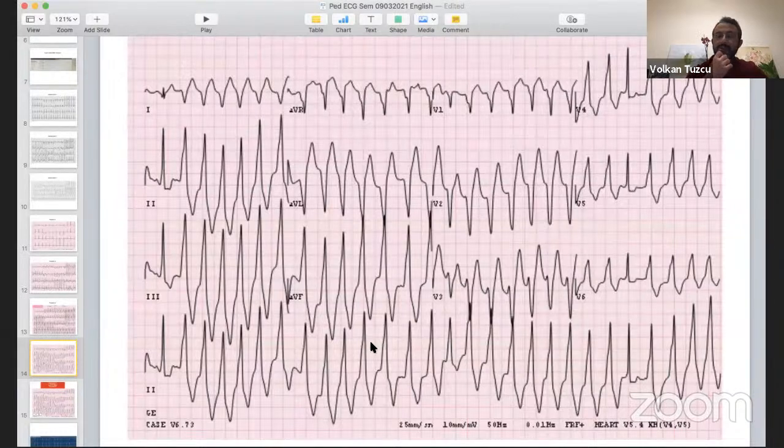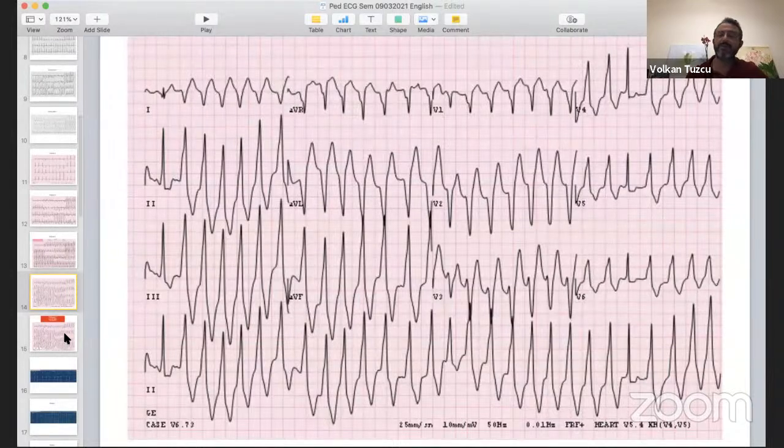So during atrial fibrillation, how do you get this wide QRS? What could be associated with this atrial fibrillation? What is the most common reason? WPW, right? Very good. And that's how these patients die, right? Suddenly, they go into atrial fibrillation. This is something we do when we do WPW EP studies and ablations. Before we do any ablation or mapping, we assess the risk of these patients. Risk meaning sudden death risk. We measure certain numbers, and we induce atrial fibrillation, and this is what we see.